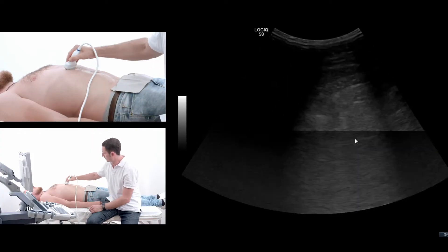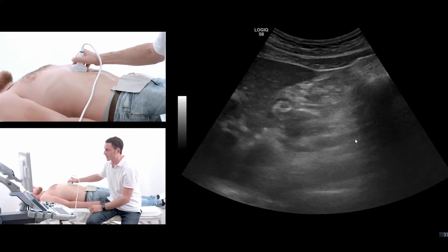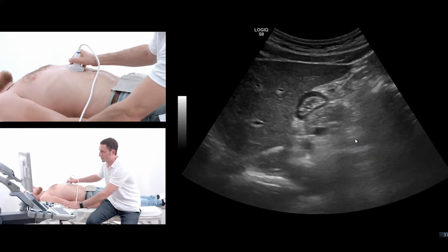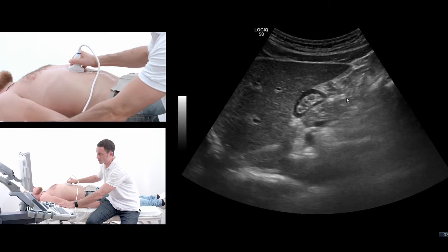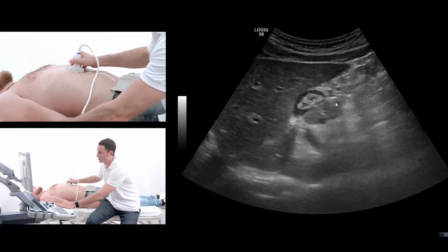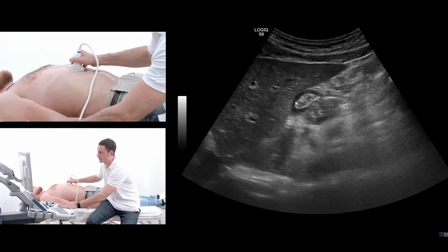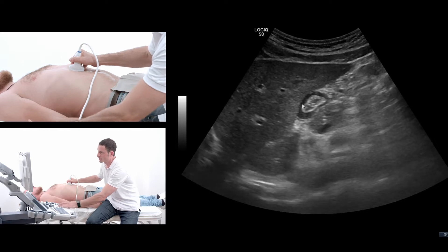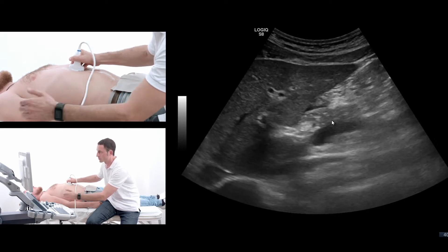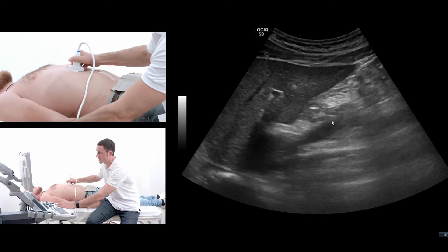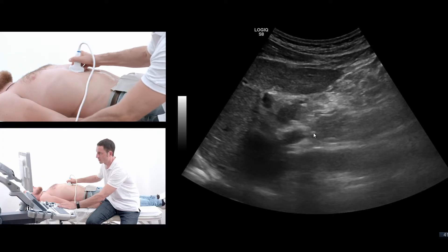When I go into a 90-degree position with the probe, I can also evaluate the pancreas in a cross-section as a long section into the body. I can see the pancreas body right behind the stomach. I can move the probe more to the patient's right side to see the pancreas head right around here.